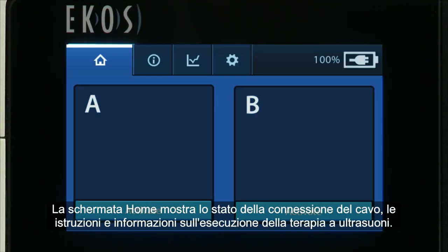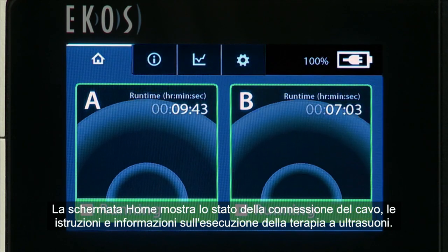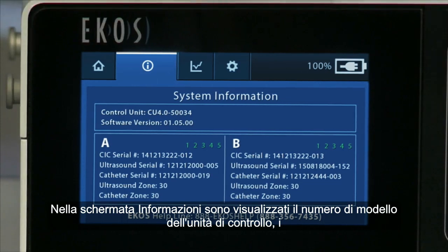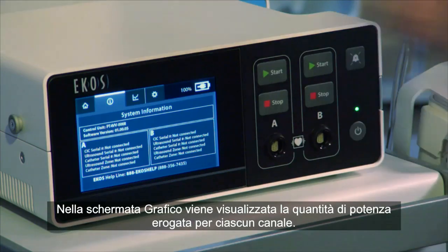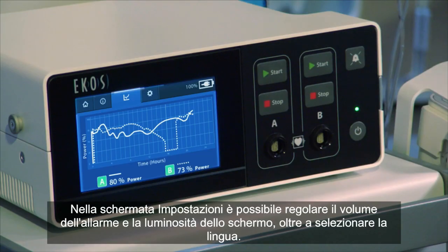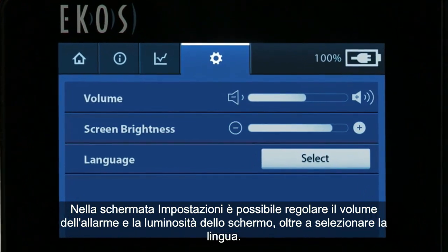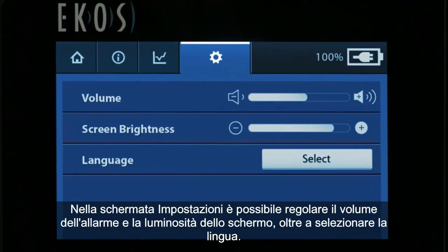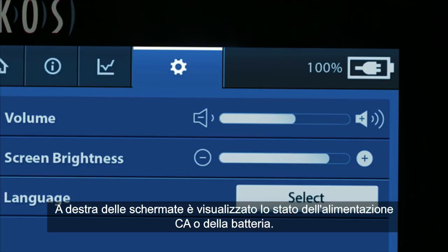The Home tab shows cable connection status, instructions, and ultrasound runtime information. Under the Information tab, the control unit model number, connector interface cable, device serial numbers, and the EKOS helpline number are displayed. The graph displays the amount of power delivered for each channel. The Settings tab is where you can adjust alert tone volume, screen brightness, and choose a language. To the far right of the tabs, the AC power battery status is displayed.